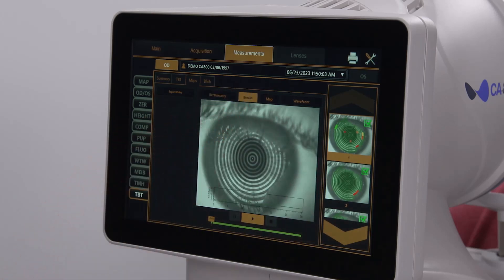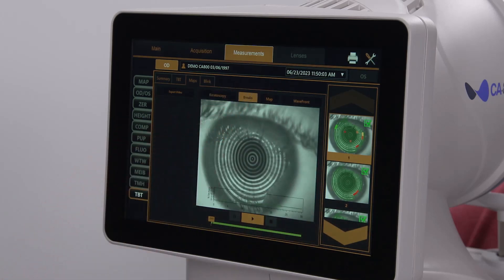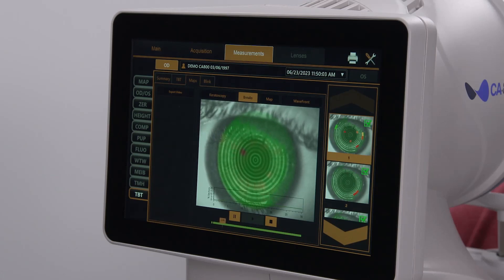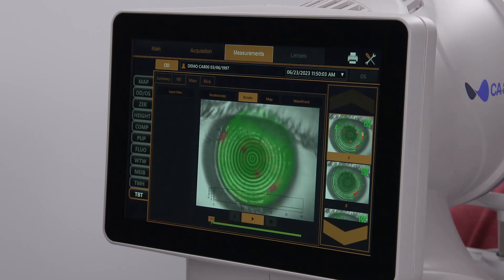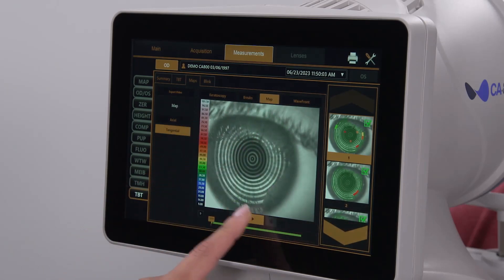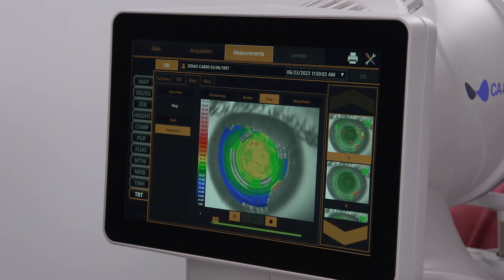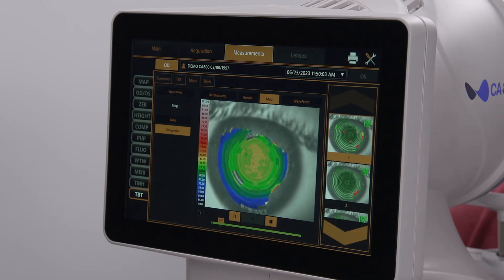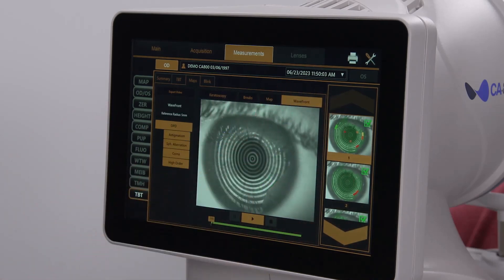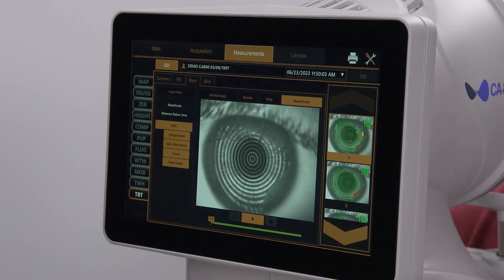The Maps playback shows how the shape or topography of the tear film changes over time. The Wavefront playback shows the effect of the thinning and breaking tear film on the aberrations of the anterior cornea.